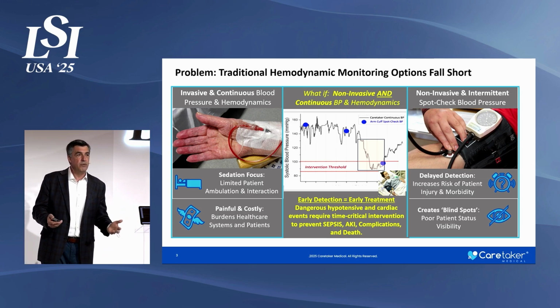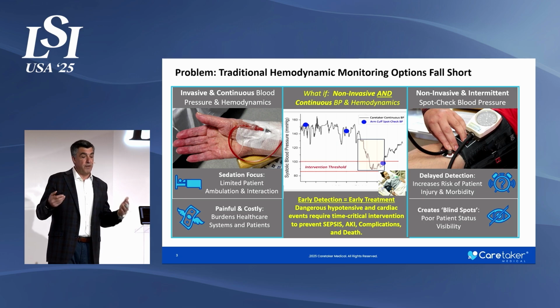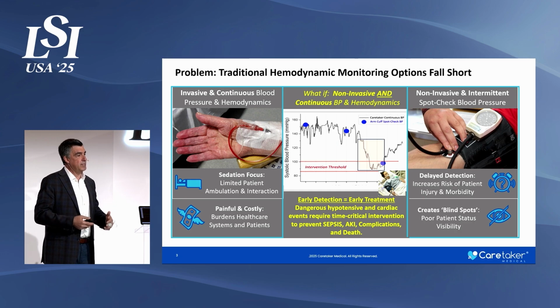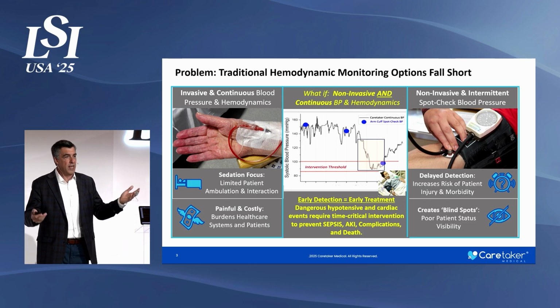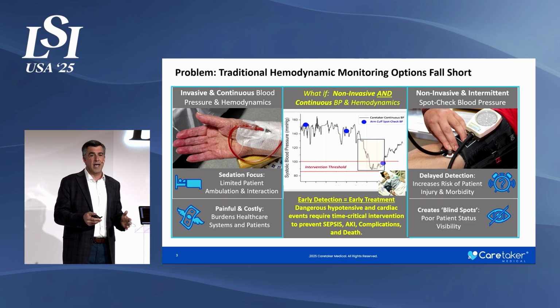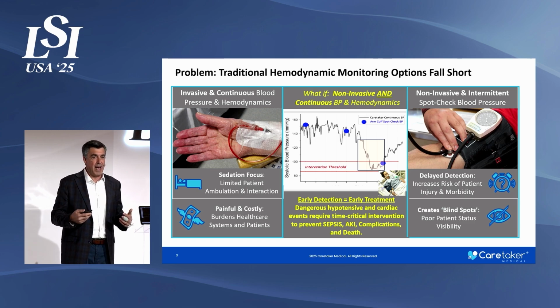The other alternative for higher risk patients that need more than spot check measurements is invasive. You can get continuous beat-by-beat blood pressure monitoring and continuous hemodynamics like cardiac output and stroke volume, and the gold standard is an invasive catheter that you see here on the left side of the screen. But the problem with that is it's costly to put in, it's time-consuming, it has dwell-time infection risks, nurses have to come level the A-line periodically, and because of those issues, it's really only relegated to the ICU and the OR. In fact, in most hospitals, you can't leave the ICU to a lower cost bed until you get rid of these A-lines and take them out of the patient.